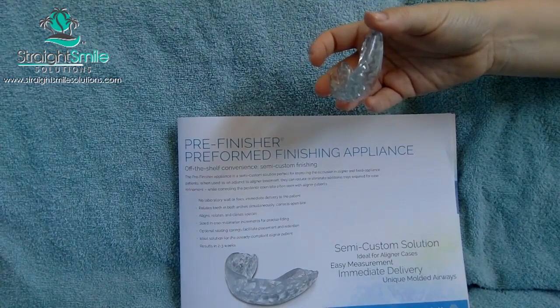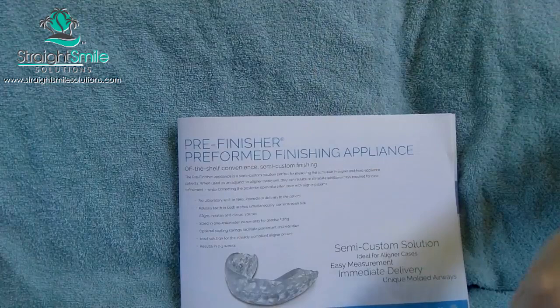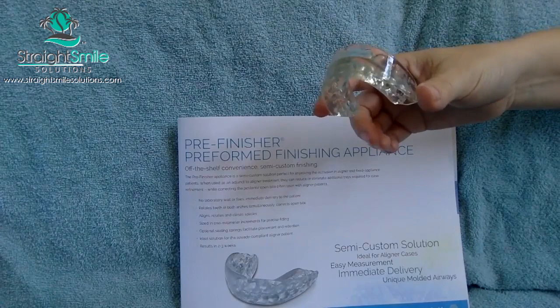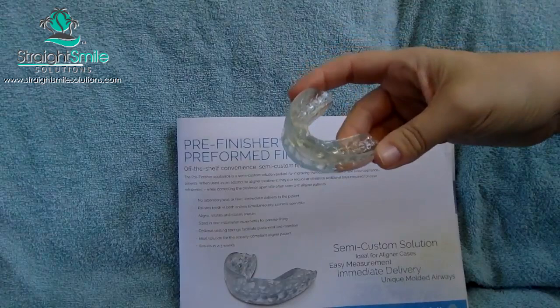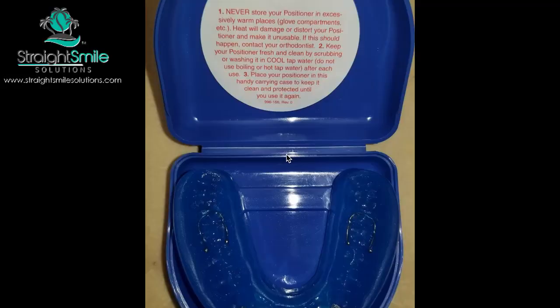I'm ball-parking the lab fee at around one to two hundred dollars for the semi-custom pre-finisher, and probably two to three hundred dollars for the full custom due to the lab work involved. There are little air holes in this one. I wore mine for a few hours today — the one I sized — and the fit went really well. My teeth were sore. I have wire retainers so there's been a tiny bit of relapse that those can't fix, and this positioner should help. I love positioners. The Healthy Start one is also patented to help with sleep-disordered breathing, which is a bonus.